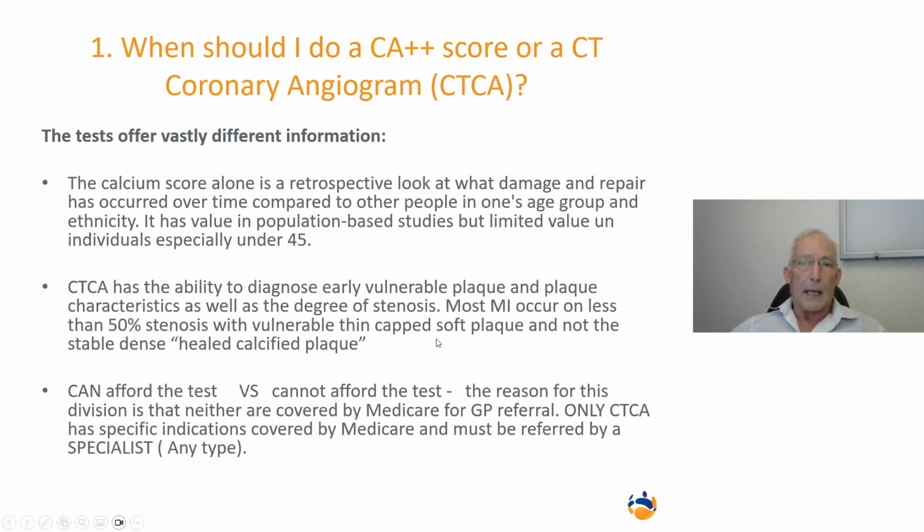The CTCA has the ability to diagnose early vulnerable plaque and plaque characteristics, as well as the degree of stenosis. Most myocardial infarcts occur with a stenosis of less than 50%, with vulnerable thin-capped soft plaque, rather than the stable, dense, and healed calcific plaque that we see when we measure calcium scores.